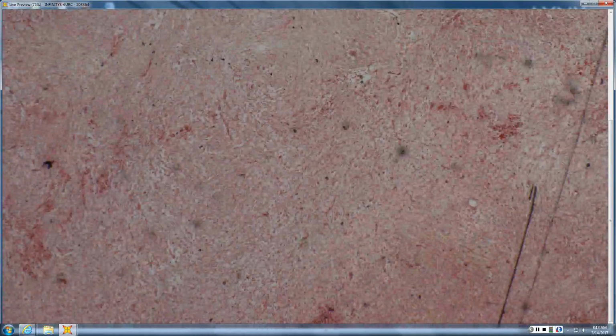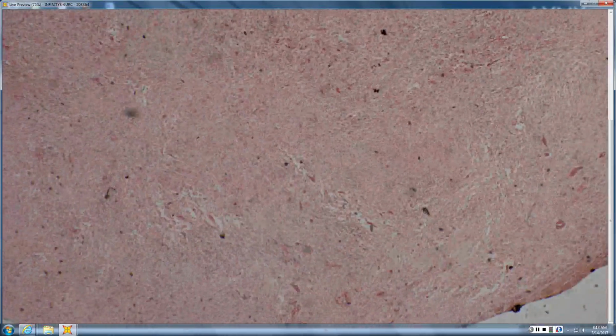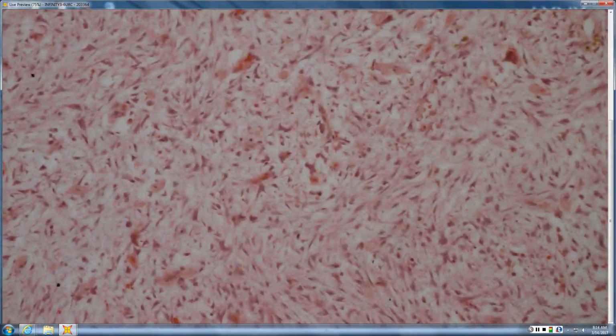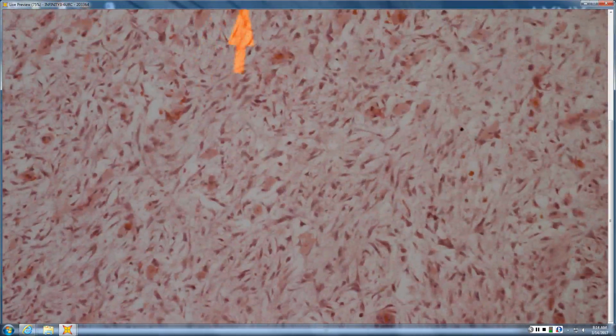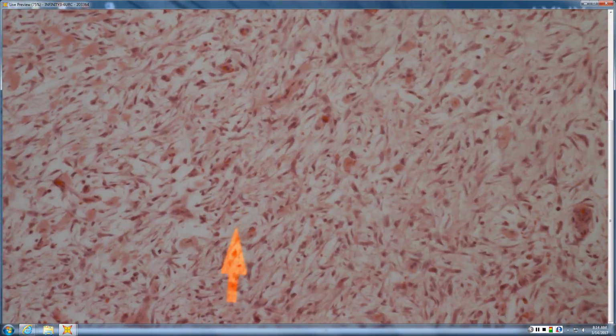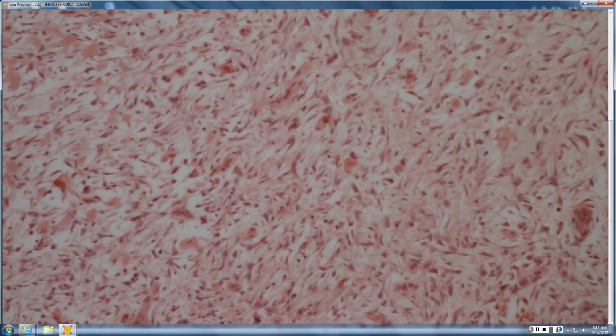Small or big? It's big. It looks like it's got those pink squiggles, which are the elastic in there a little bit. When you look at the cells, first off, it's loose. You have lots of these red things. What are the little red things? Oh, those are like actin. Right. These are bright red, like erythrocytes. Oh, okay. So lots of extravasated erythrocytes. And if you look at the fibroblasts, what do they resemble? Like tissue culture fibroblasts.